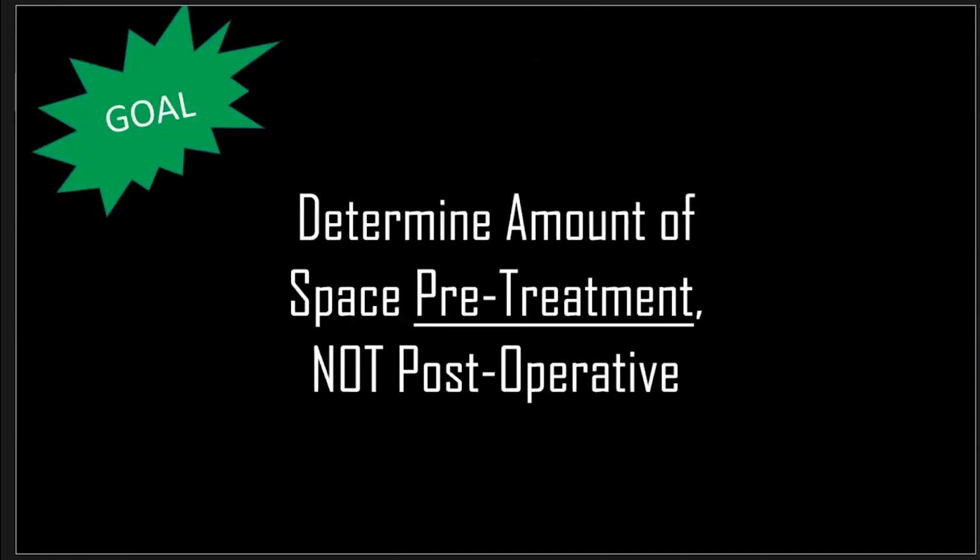Our goal with implant dentistry is to determine the space pre-treatment, not post-operatively. Again, the patient's coming to us for a restoration of their teeth. They don't care about the size of the implant or the brand of the implant. They just want their teeth back, whether it's 1 tooth or a full arch of teeth, they want their teeth back.